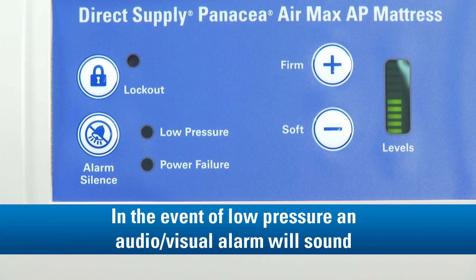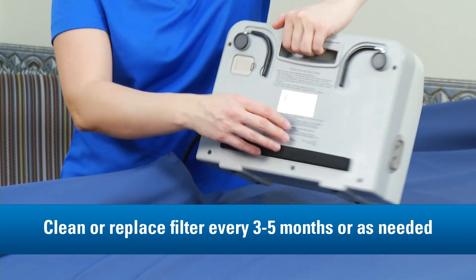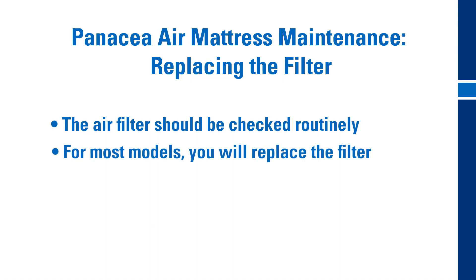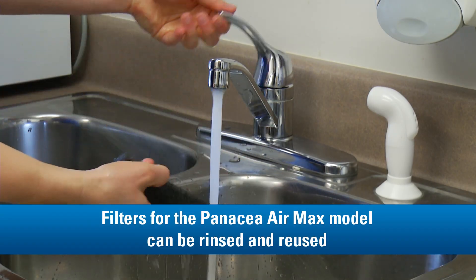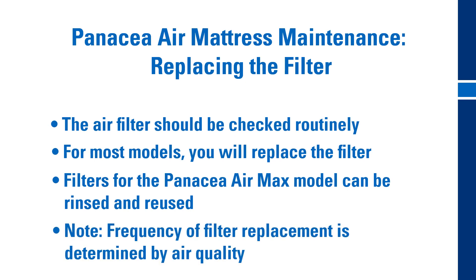In the event of low pressure, an audio and/or visual alarm will sound. The air filter for the control unit should be checked routinely for signs of dirt or contamination. For most models, you will replace a dirty filter with a new filter. For the Panacea Air Max model, the filter can be rinsed and reused. Please keep in mind the frequency of replacing depends on the air quality.